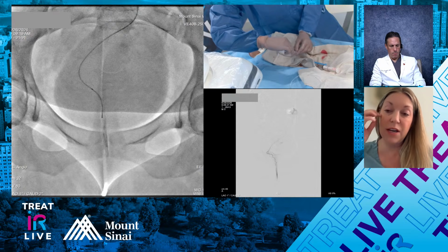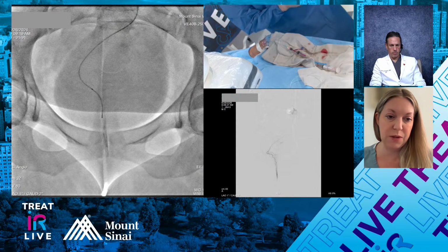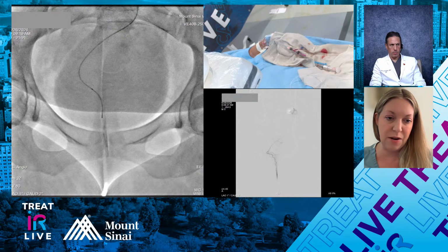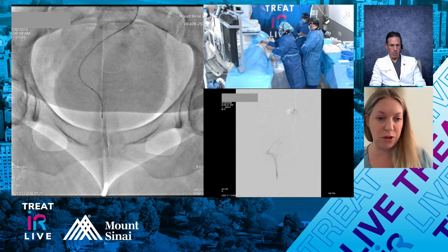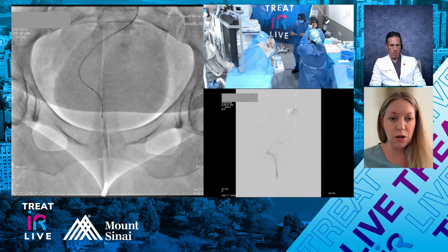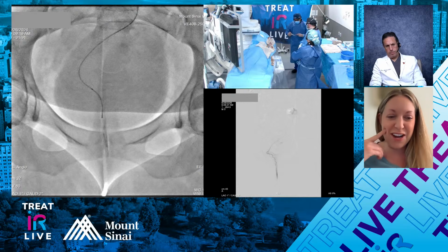Yeah, I mean, this is where I spend sometimes my time. They get pretty small higher up, so you might not be able to. But again, around the area that you're at right now, I think is ideal. I'm just gonna agitate this again. Looks like you're having no trouble reaching there with your micro, so that's great. That was a pretty great move. He just slid it down. Yeah, very slick.